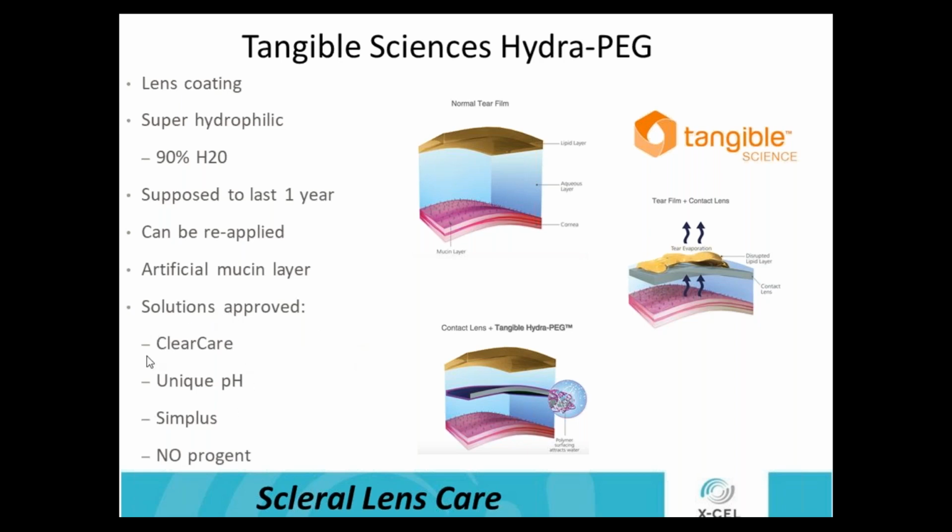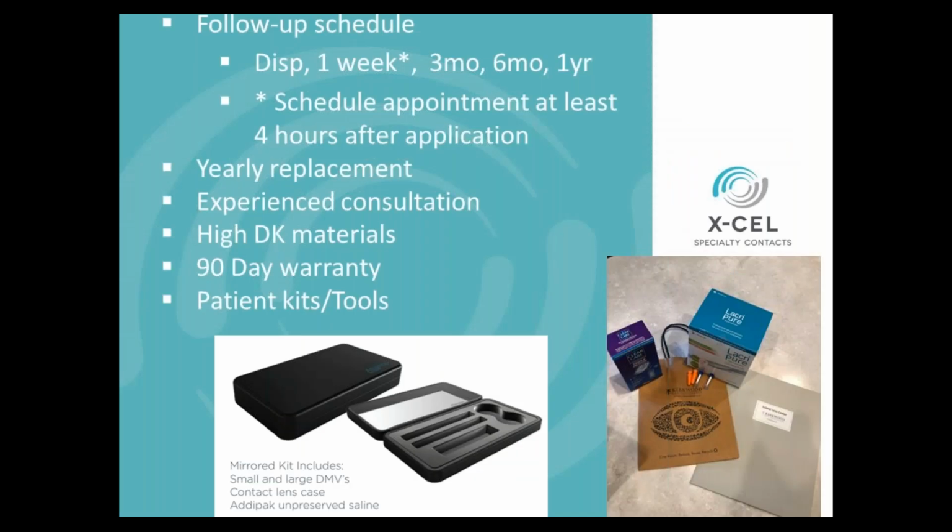Also, the one thing with this is you've got to be compliant with the care systems, so know what care systems are approved with it. You can use ClearCare, Unique pH, or SimPlus with the lens for your cleaning regimens. But another nice option, just to not have problems later in that fitting process, or even down the line a year after you've fit that patient.